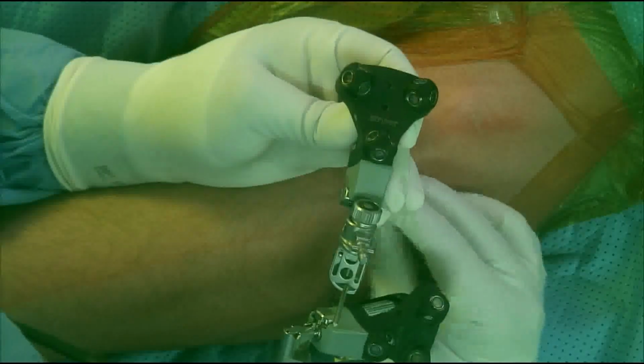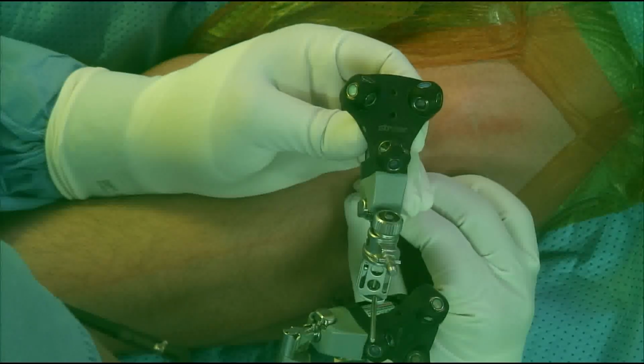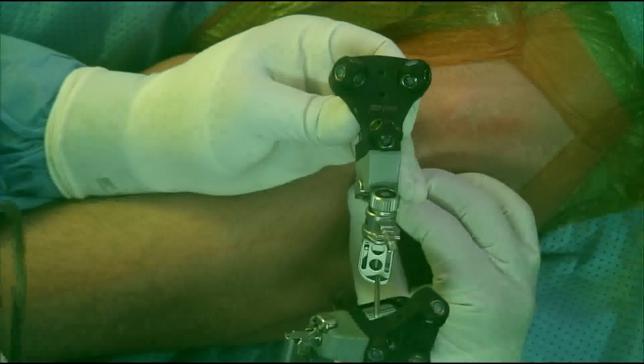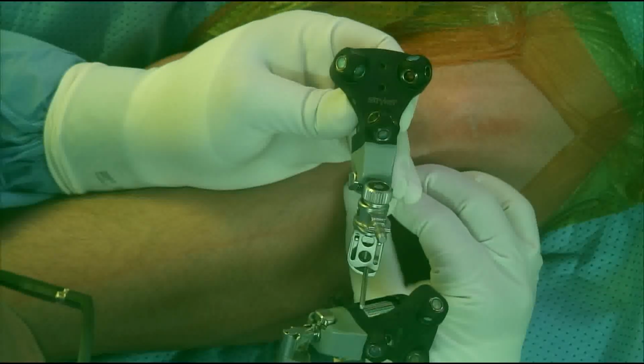And here I'm trying to use my device, using the navigation system, to be exactly in the direction where I want to be. And my assistant used the hammer to hammer the tip into the osteoid osteoma.